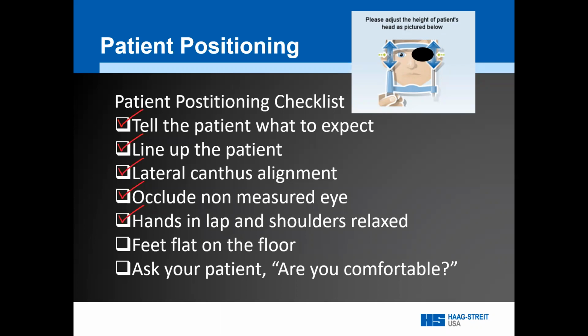Now, this next one might sound a little strange at first, but briefly check the patient's feet to make sure they're flat on the floor and the patient is stabilized. A patient who's bouncing on the balls of their feet or dangling their feet from the chair is more likely to move. Lastly, right before you begin scanning, ask the patient, are you comfortable? The patient might look all right to you, but if the patient isn't comfortable, again, they're going to be more likely to move, and movement is not our friend with really any device. So many of these tips can be used for other tests as well.